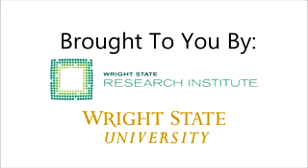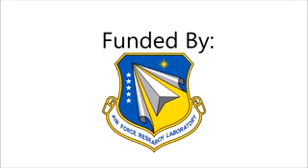The FEM modeling of the electrical brain stimulation presented here was performed at Wright State Research Institute at Wright State University in Dayton, Ohio. This work was funded by and developed in cooperation with the Air Force Research Laboratory. It was developed with standard commercial hardware and software.